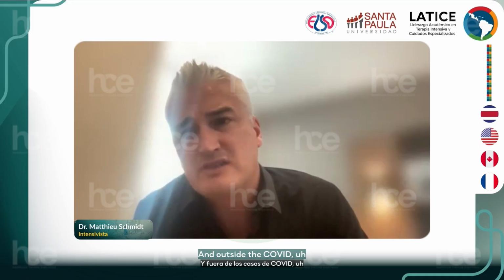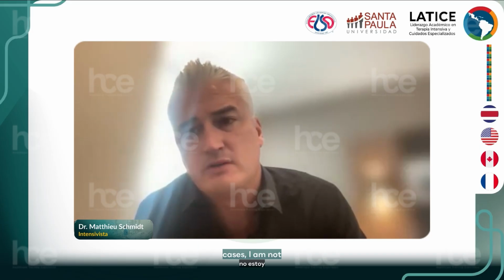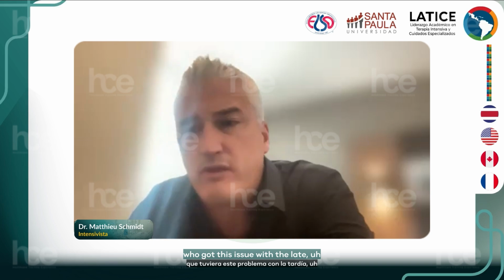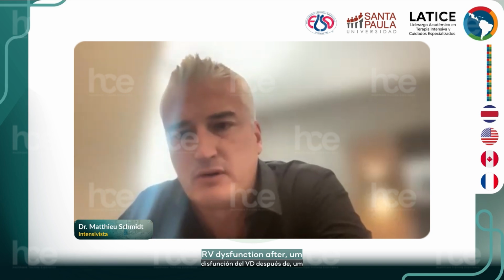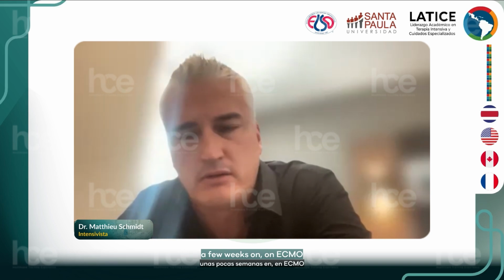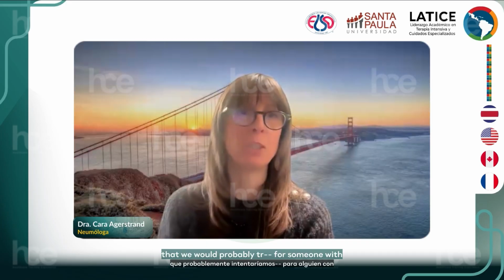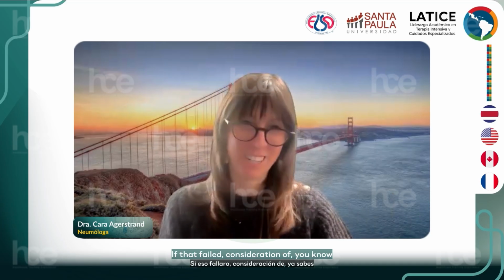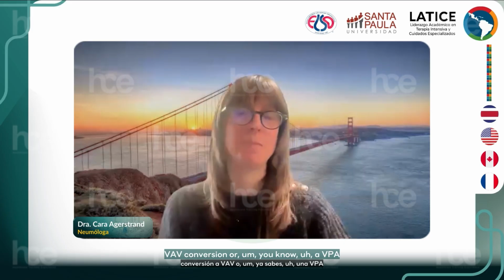Yeah. And outside the COVID cases, I don't remember any non-COVID patient who got this issue with a late RV dysfunction after a few weeks on ECMO. Our approach would be similar in that for someone with progressive RV dysfunction, we would probably try a little bit of inotropy. If that failed, we would consider VAV conversion or a VPA.